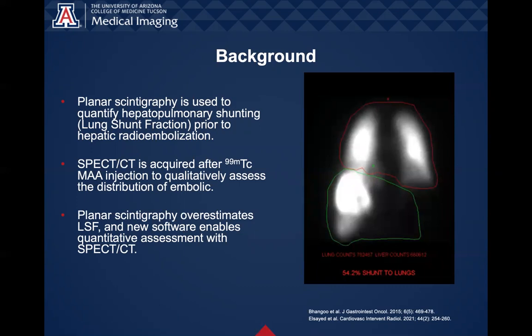However, nearly all of the patients in these studies have already low planar lung shunt fractions, often less than 5%, which is likely to be clinically irrelevant. Therefore, the clinical and dosimetric impact of lung shunt fraction overestimation by planar scintigraphy is unknown.